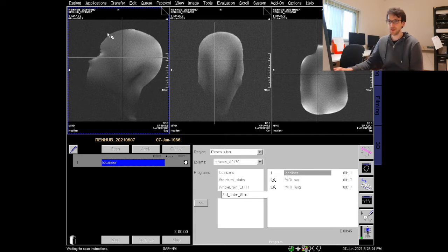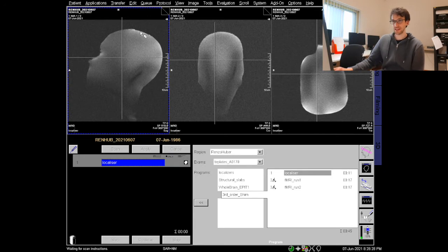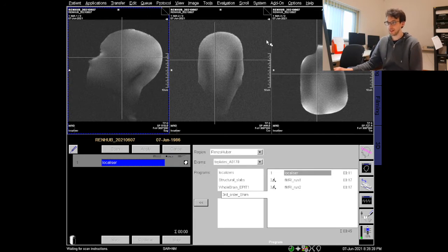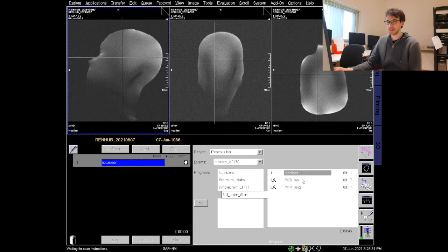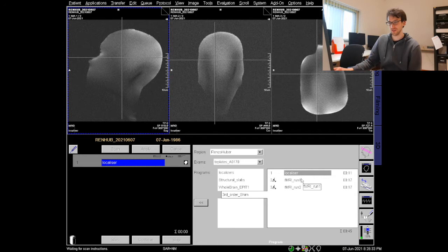So here we have our three views: our sagittal, coronal and axial and we can start to align our functional sequence.